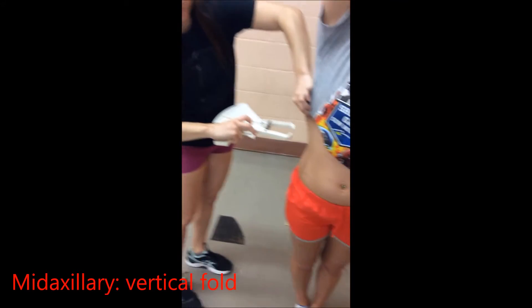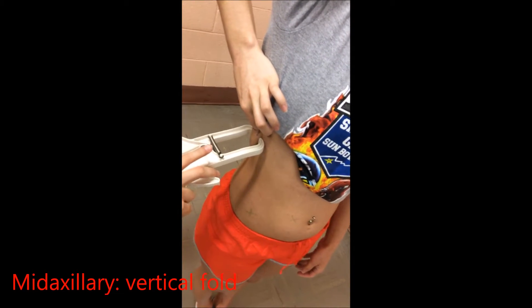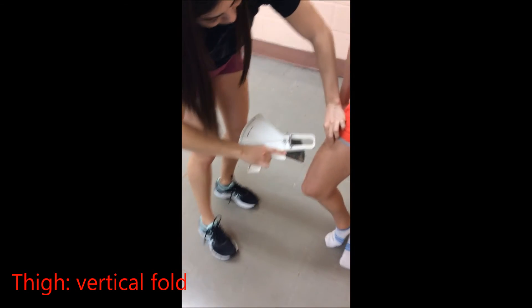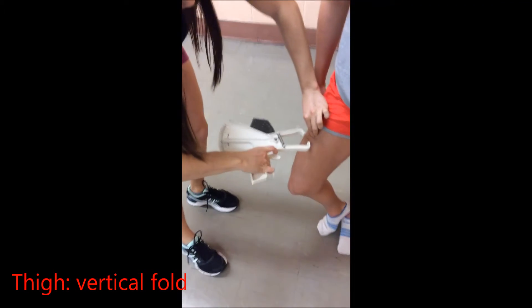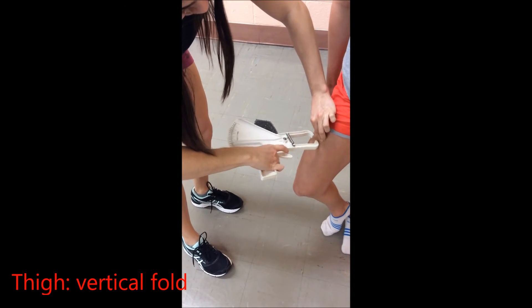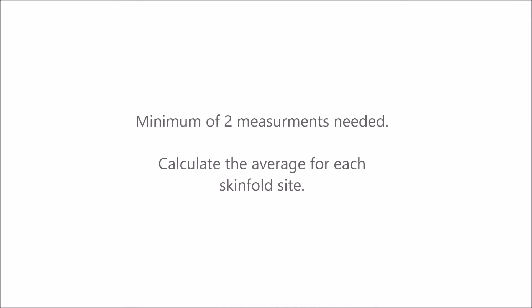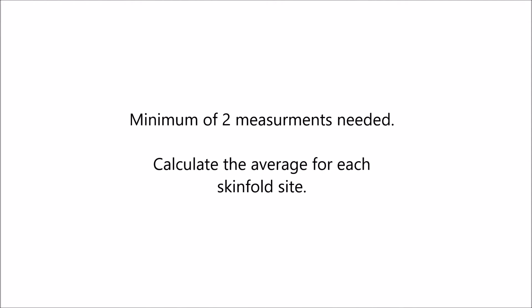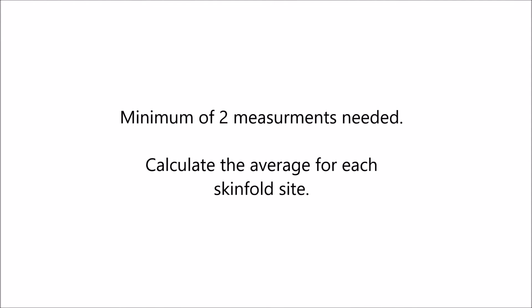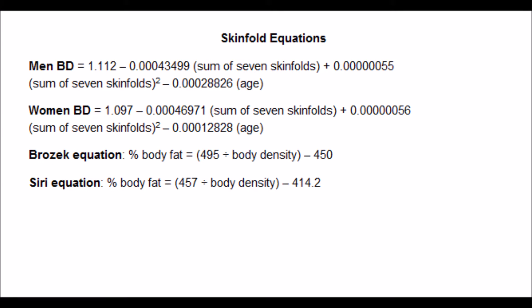Record the skin fold measurement to the nearest 0.5 mm, 1-2 seconds after releasing the scissor grip. Take skin fold measurements in rotational order to allow time for the skin fold to regain its normal thickness. Take a minimum of two measurements at each site. If duplicate measurements are not within 1 or 2 mm, retest that site.